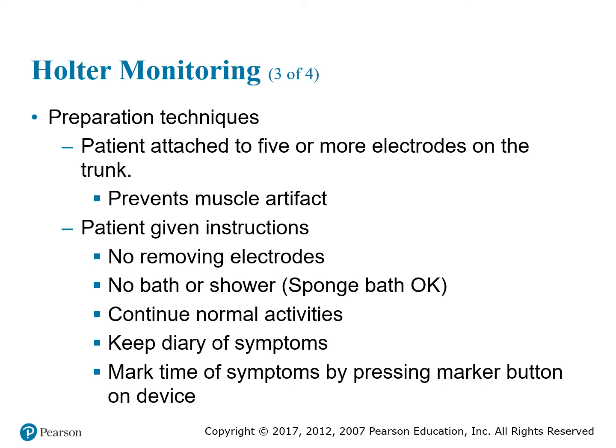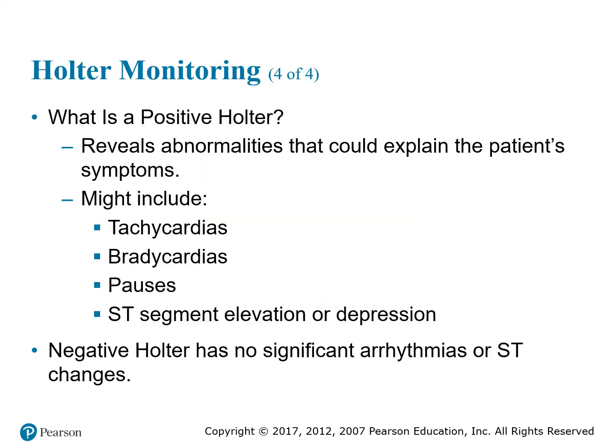Prior to the Holter monitor, the patient must be thoroughly instructed on its proper use. They have to maintain a diary, which is vital for accurate interpretation and evaluation of the results of the EKG tracing.